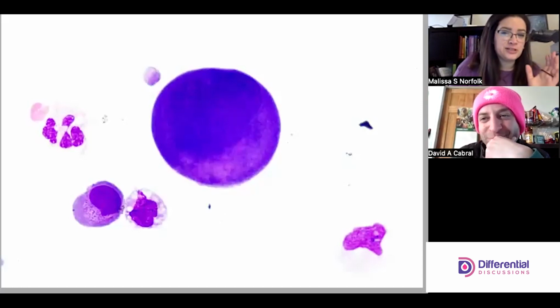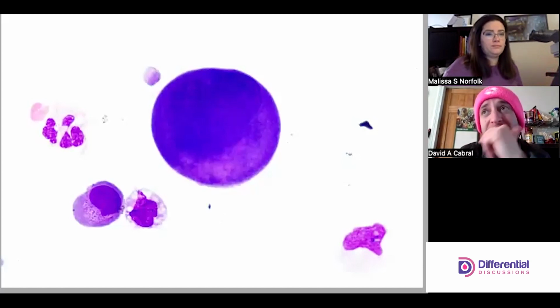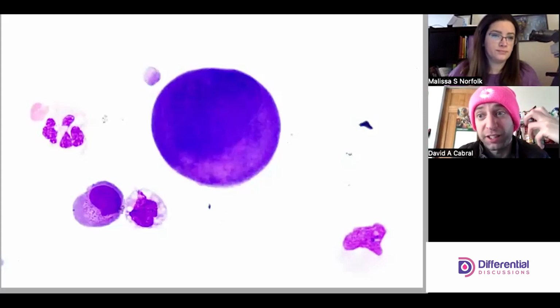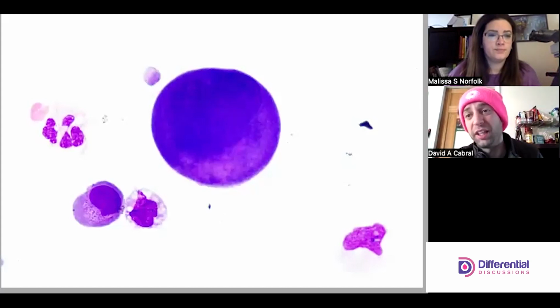So there's really no point in remaking it unless it's for sure the stain, and like Dave said, we know it's not because of these other cells over here. That's an excellent point, and it's a thing that some texts tend to do: you're really putting your finger on the scale and getting rid of the objectivity that we're supposed to represent. It's just not good practice.